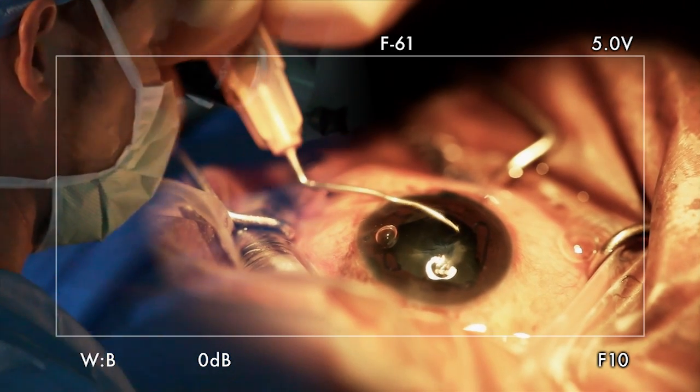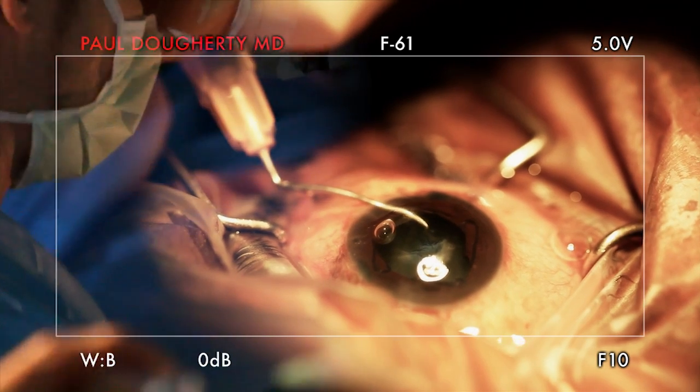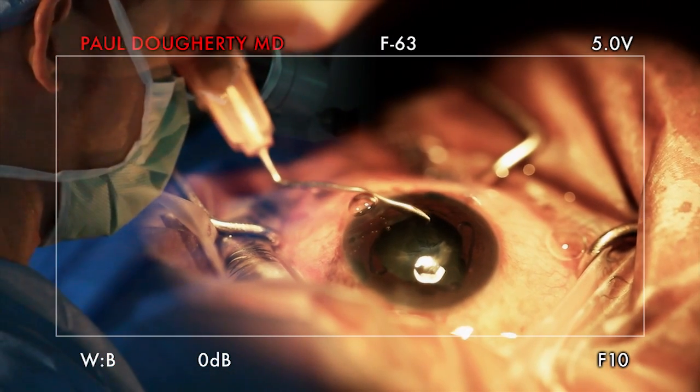You know, eventually the viscoelastic's going to run out. So there's fibrosis there. So we just need to find that bag.